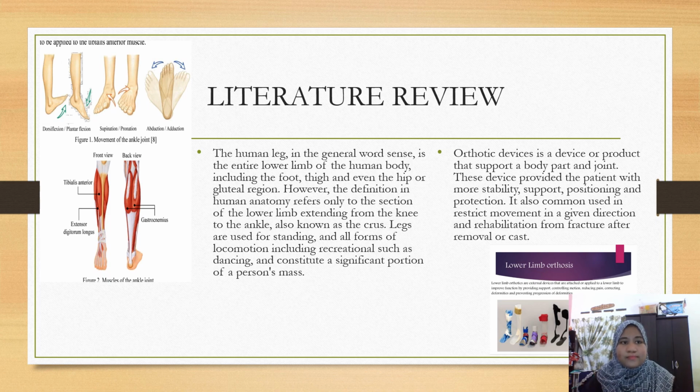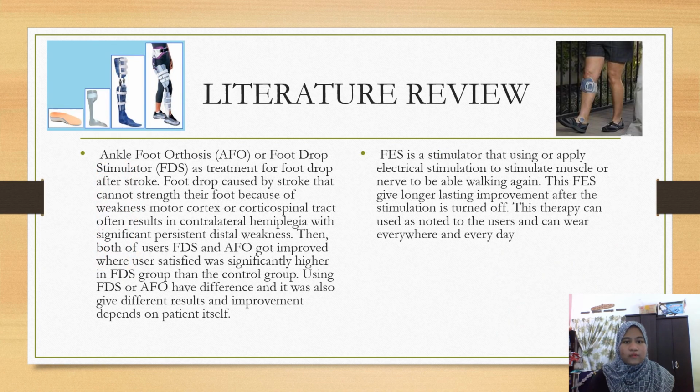Ankle foot orthosis, AFO, or foot drop stimulator, FDS, as treatment for foot drop after stroke. Foot drop is caused by stroke. They cannot straighten their foot because of weakness. Damage to the motor cortex or corticospinal tract often results in contralateral hemiplegia with significant persistent distal weakness. Then both users of FDS and AFO improved, when user satisfaction was significantly higher in the FDS group than the control group.